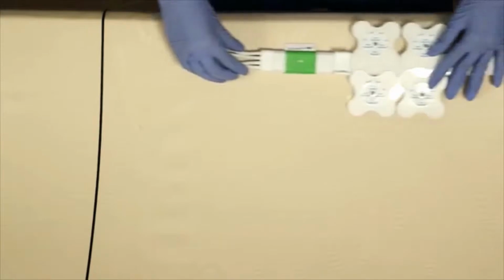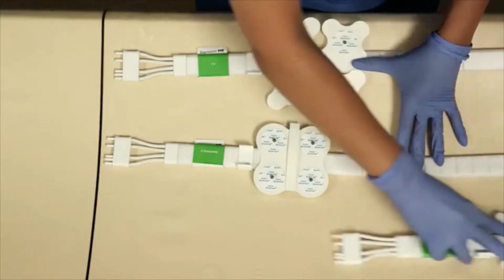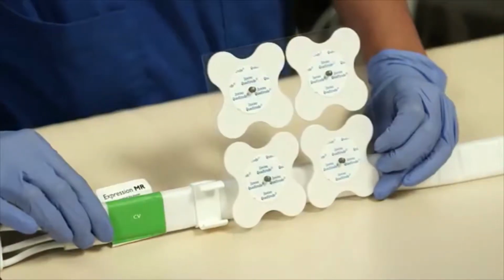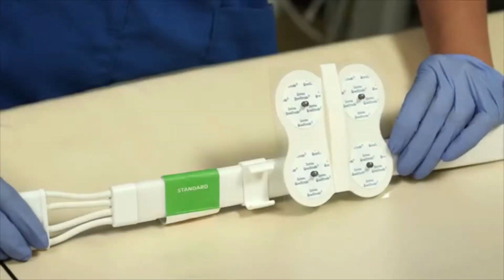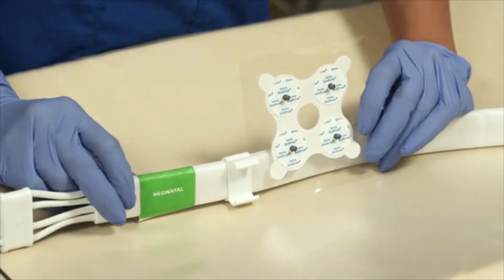Before placing ECG leads on the patient, you want to make sure you pick the correct electrode with the correct ECG cable. There are 3 types of ECG cables that pair with the 3 different electrodes. The CV ECG cable is made for the CV quattrodes, which are the quattrodes that are separate. The standard cable is made for the single patch quattrode, and the neonatal cable is made for the neonatal quattrode.